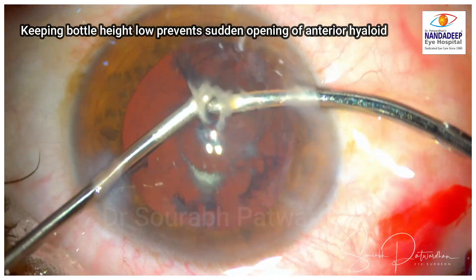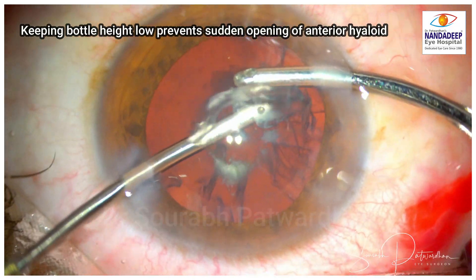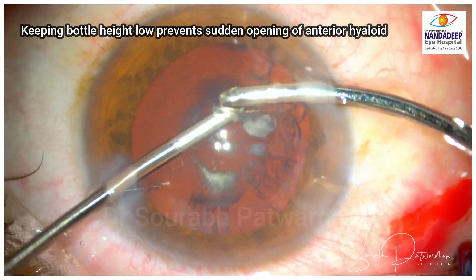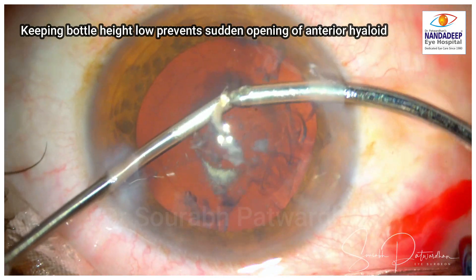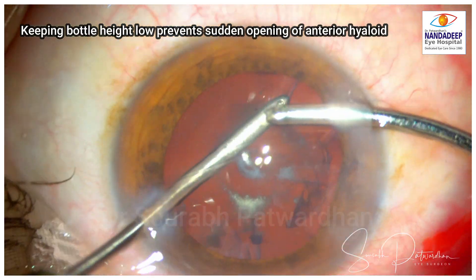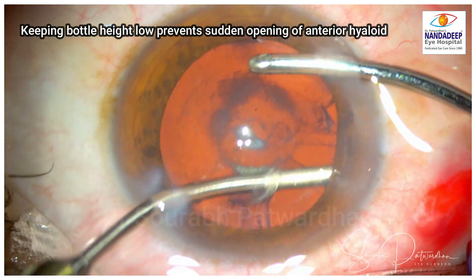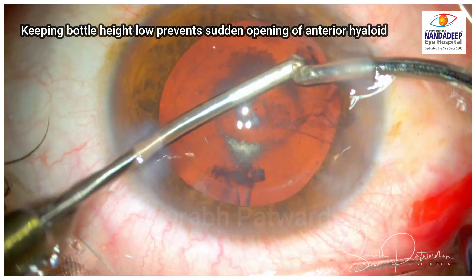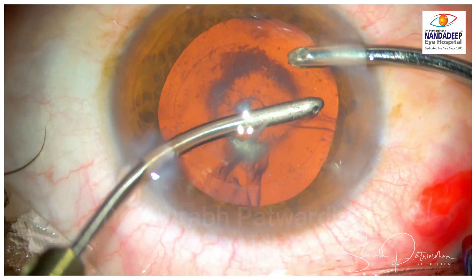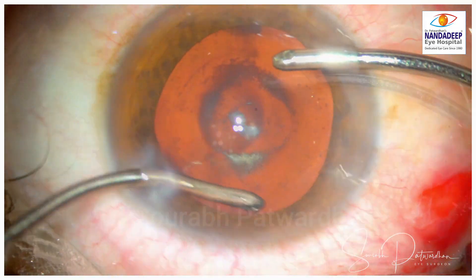Keeping low bottle height or low IOP prevents sudden opening of the anterior hyaloid or posterior capsular rupture. You have to be very gradual, using low vacuum settings and a bottle height of only 60 to 70 centimeters. That will slow down the procedure a bit but will be very safe for the posterior capsule, as you can see after I have removed the posterior plaque.